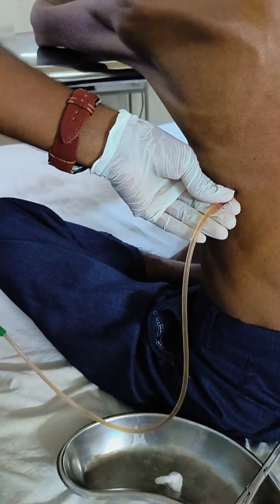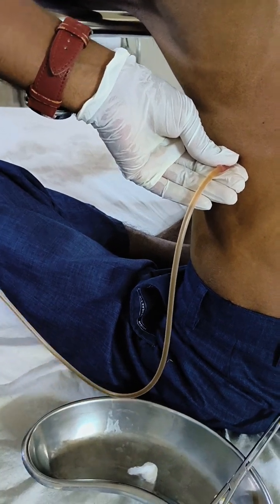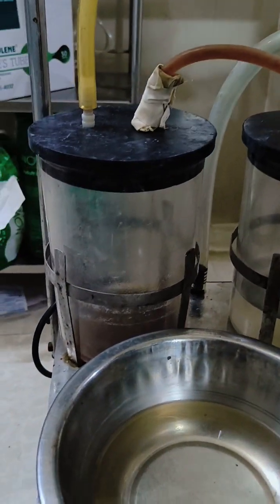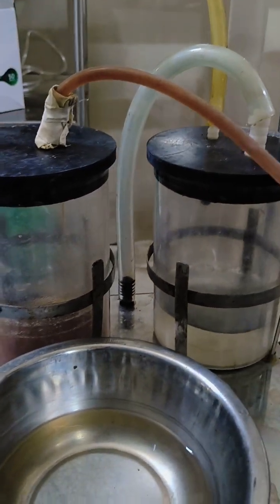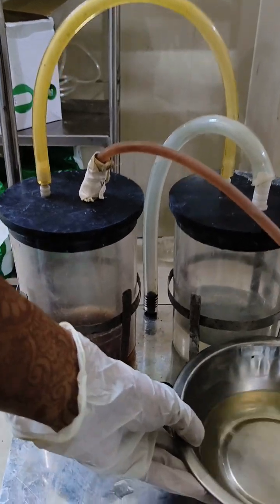You can see the fluid falling into the suction machine. It's coming. It's falling.